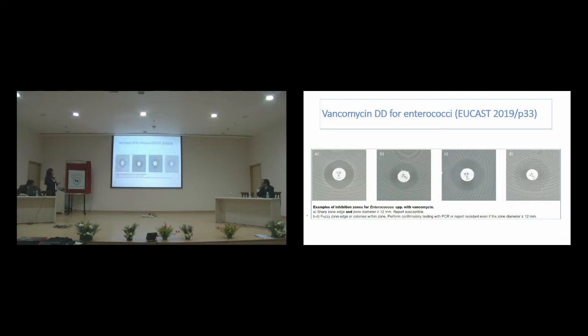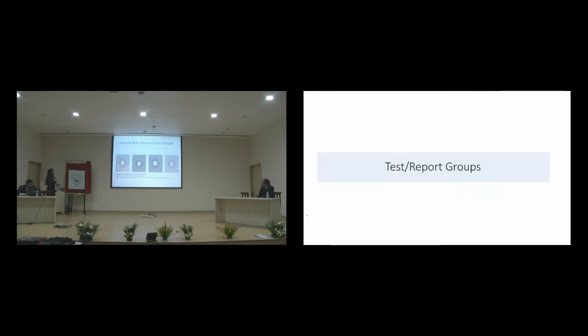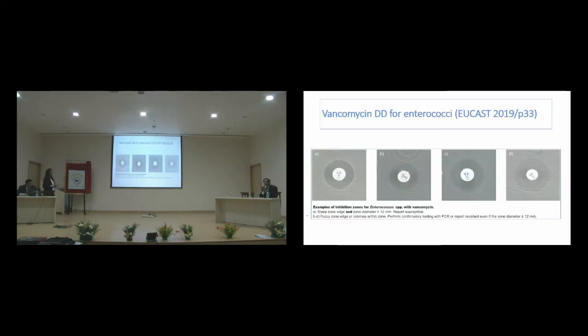Whenever there is a clear zone edge, we can take the reading, and if it is more than the clinical breakpoint of sensitive, report it as sensitive. If there is a more fuzzy edge or the colonies are seen inside, it is better to repeat the test or do an alternate test. Can you show the previous? Yeah. In the fourth figure that's being shown, the first thing you should decide is, are you dealing with a pure organism here? It's quite possible that you have put in a mixture, and the zone is actually valid. A second organism is growing inside with a different zone. So always be sure in such situations that you are dealing with a pure culture.